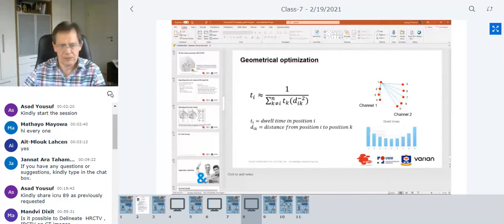And what you get is a kind of dwell time distribution that looks like this here. So it's purely based on the 3D coordinates of your source positions. And it's a relative dwell time distribution. It must be normalized to a point. Yeah, that was invented many years ago by Craig Edmondson, and then it was put in the first Nucletron planning system, the NPS, because they were a Nucletron user at that time. But it's a very simple, very effective algorithm.